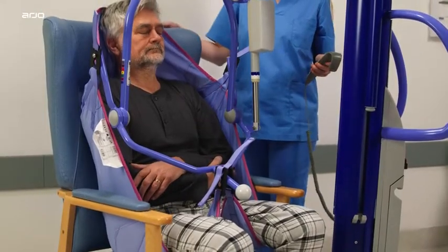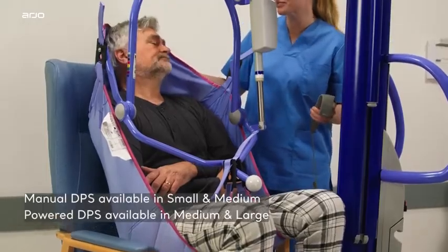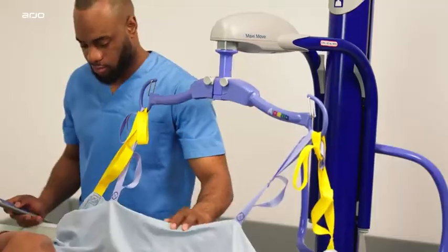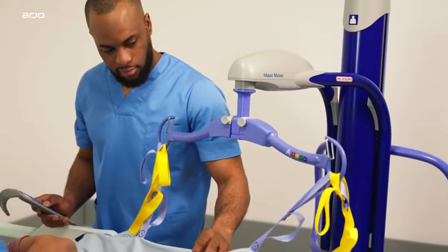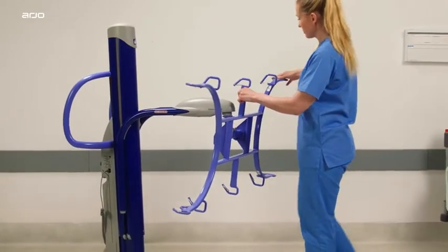The optional spreader bars available to use with the MaxiMove include PDPS, Powered Dynamic Positioning System, for use with Arjo's patented clip system; a two-point hook spreader bar; a four-point hook spreader bar; and a stretcher frame for use with loop slings.